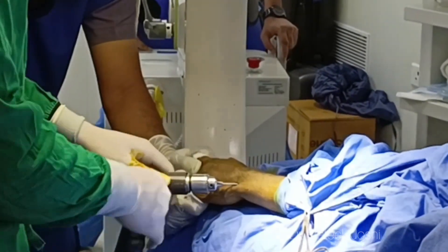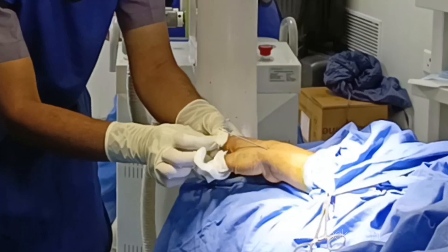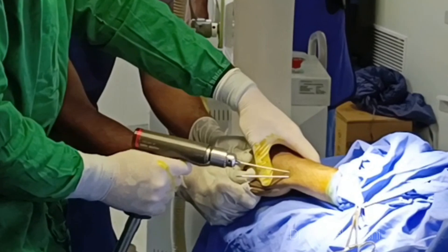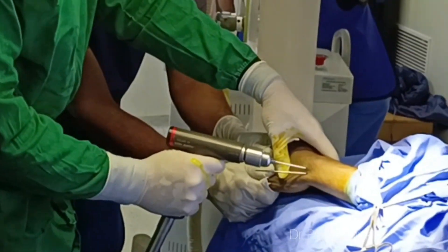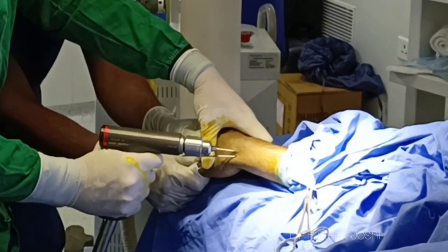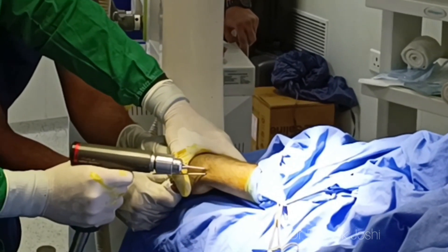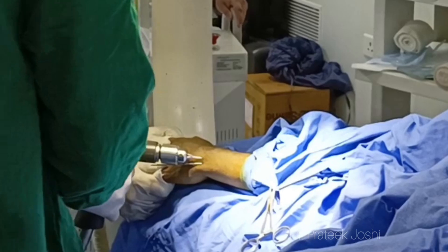We have advanced our first K-wire and now we are going to insert another K-wire slightly more dorsal to this. The most common complication during this wiring procedure is damage to the thumb extensor tendons, so we should first try to feel the bone and drill only as much as is required. This is going to prevent inadvertent damage to the tendons lying just next to the radial styloid.